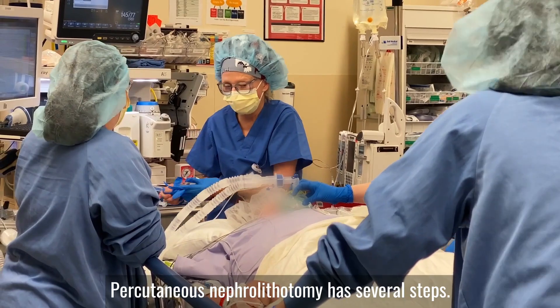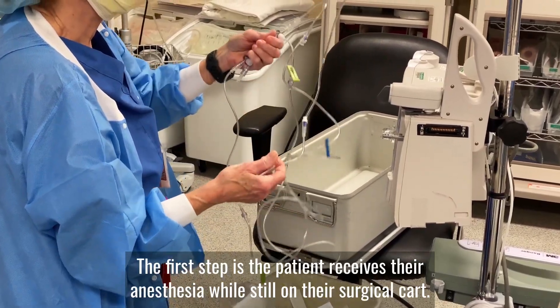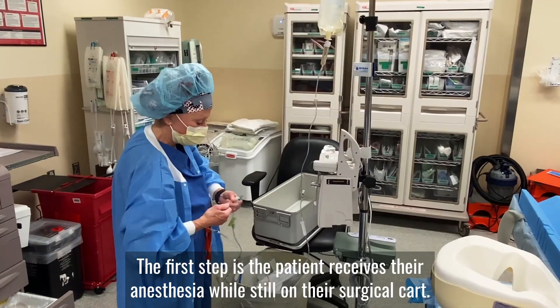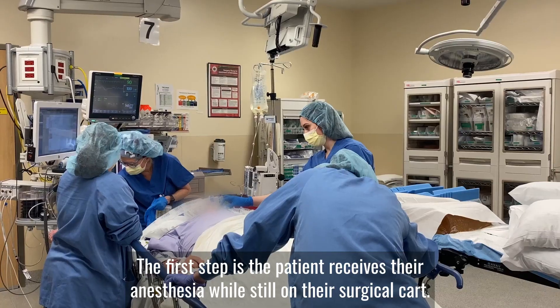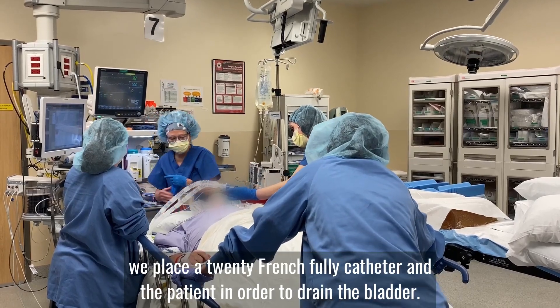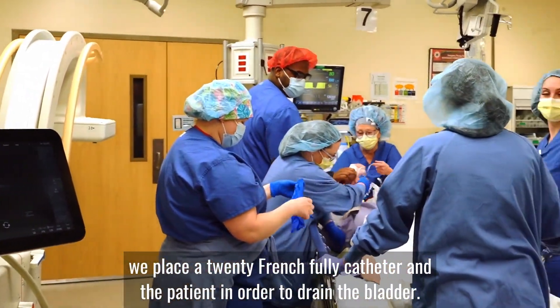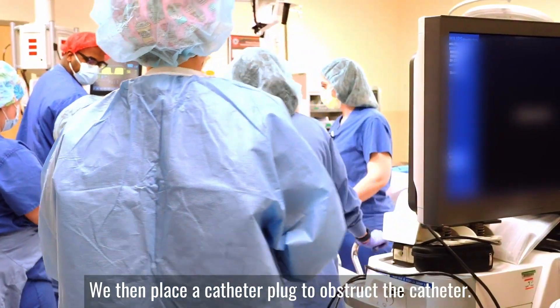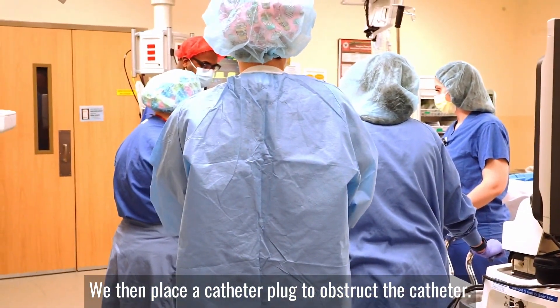Percutaneous nephrolithotomy has several steps. The first step is the patient receives their anesthesia while still on their surgical cart. After the patient receives their general anesthesia, we place a 20 French Foley catheter in the patient in order to drain the bladder. We then place a catheter plug to obstruct the catheter.